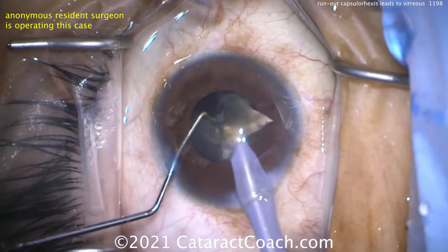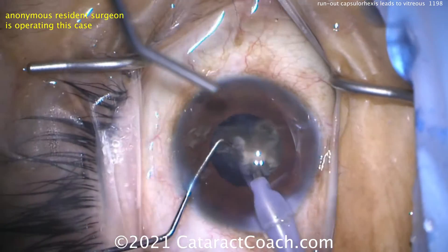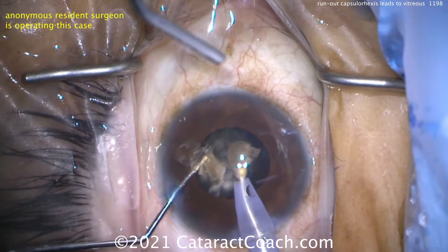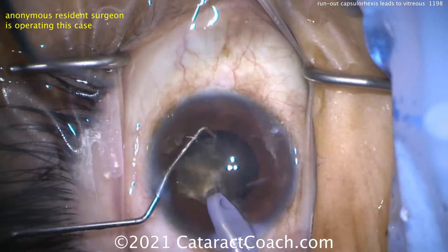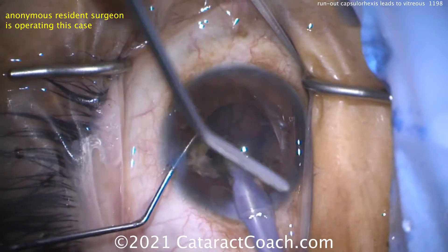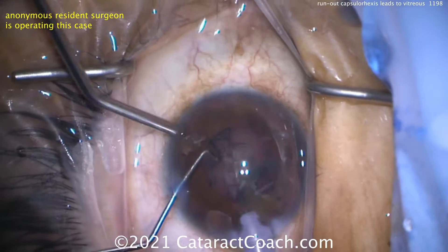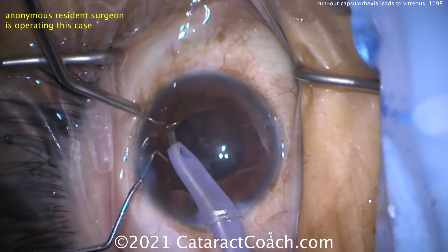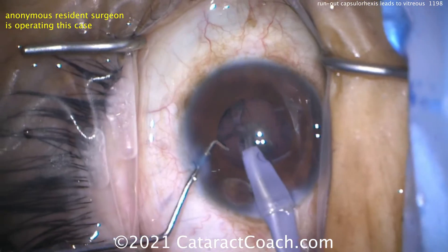The resident is doing a great job here with a chop technique — good work staying centrally. The overall video is about an eight-and-a-half to nine-minute video, but remember in real life this case was 45 minutes, maybe even close to an hour. Things take time, and you'll see that especially when we get to the vitreous prolapse. All the pieces are coming out nicely; I think you still have an intact anterior hyaloid face.